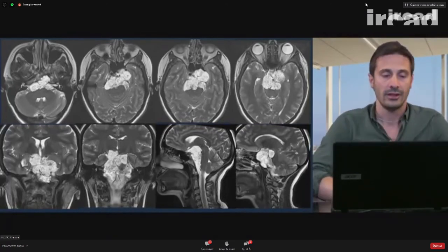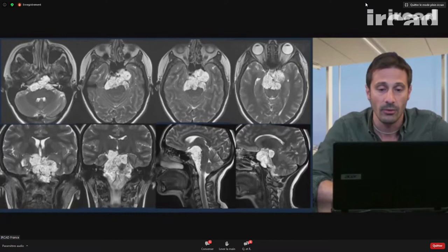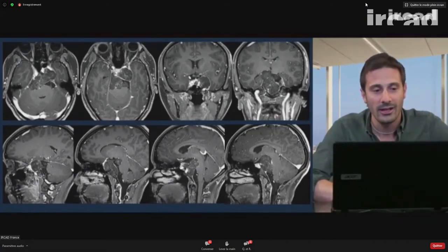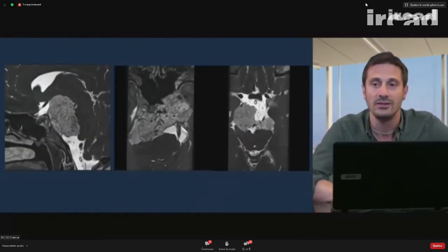I will go briefly into the characteristics of this lesion. So it has apparently both an extradural and intradural extension, with an extension mostly laterally on the left side, but also on the right side. As you can see here, very close to the internal acoustic meatus on the right side, and an invasion of the cavernous sinus on the left side. The intradural portion is very clear here, very adherent apparently to the brainstem. So you can see the long axis of the tumor actually is from the right inferior part going anteriorly on the left side. So it's a huge lesion, and we questioned ourselves how to treat this.